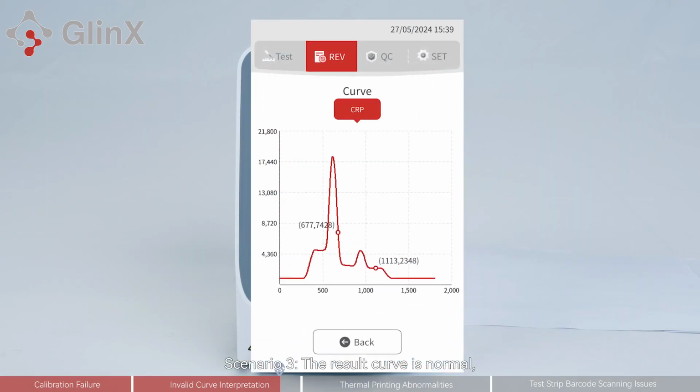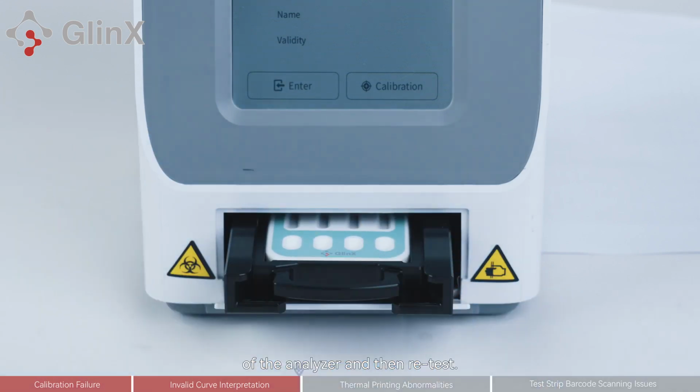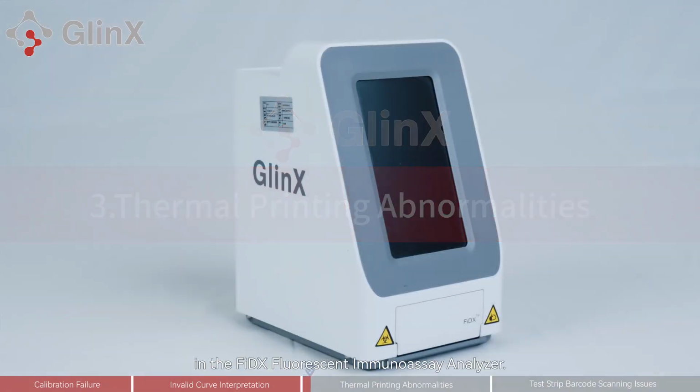Scenario 3. The result curve is normal, but the fluorescence collection point isn't at the peak of the curve. When this happens, it may be due to the test strip adapter not being pushed into place properly. To address this issue, simply push the test strip adapter to the innermost end of the analyzer and then retest. The third part covers the troubleshooting of thermal printing abnormalities in the FiDX Fluorescent Immunoassay Analyzer.